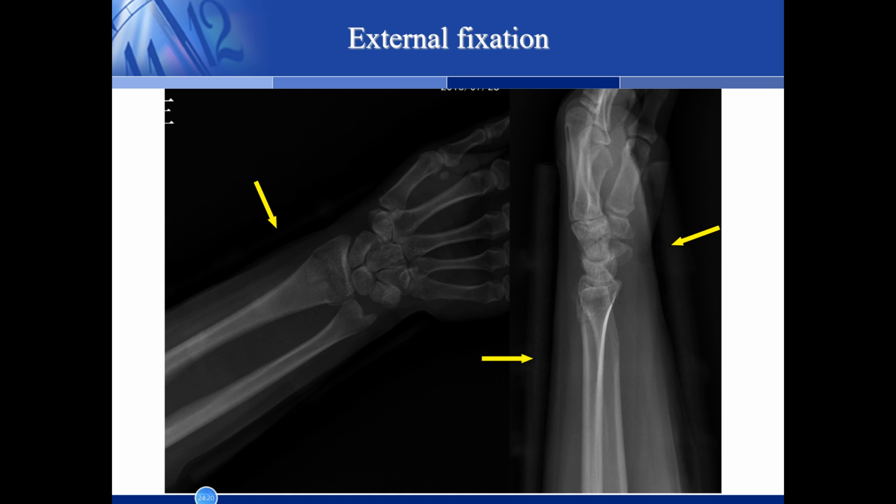After external fixation, the displaced part of the fragments becomes normal. Here is the external fixation.